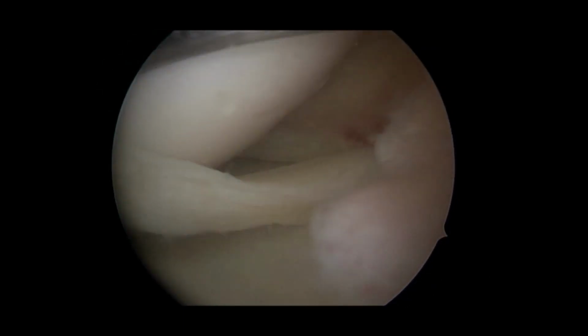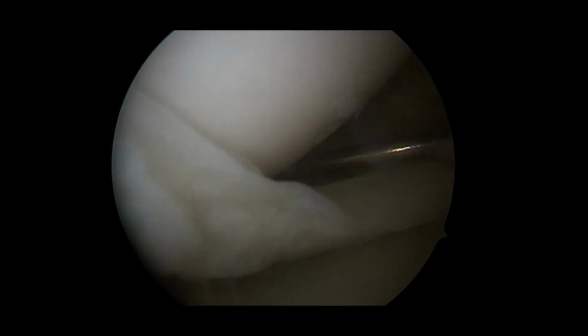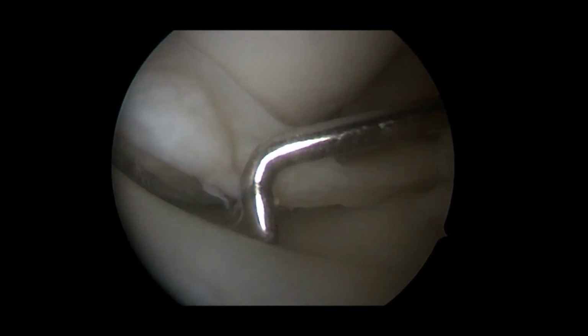The tear of the medial meniscus, and as you can see, it is a bucket-handle tear, and this medial fragment is lying loose inside the joint, and due to its entrapment between the medial femoral and the medial tibial condyle, it is causing loss of range of motion, locking, and pain to the patient.